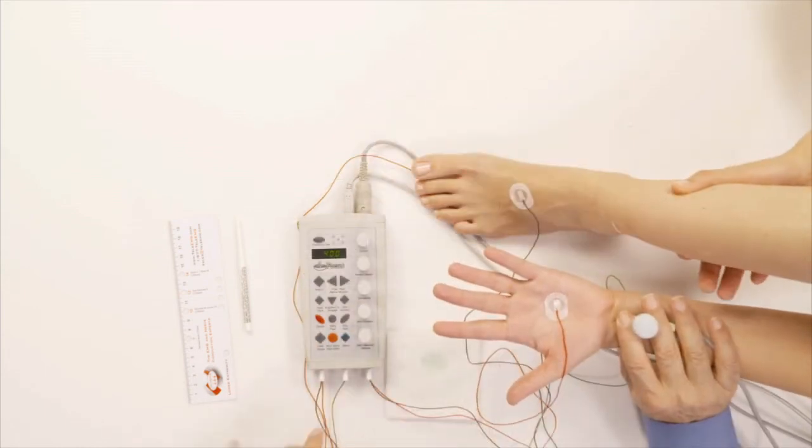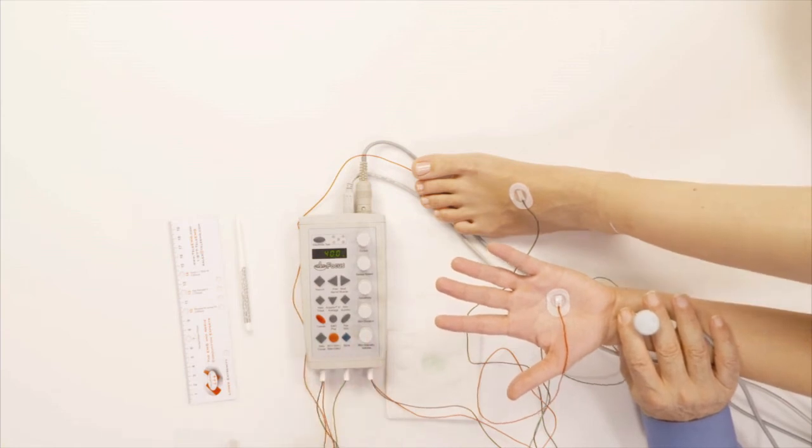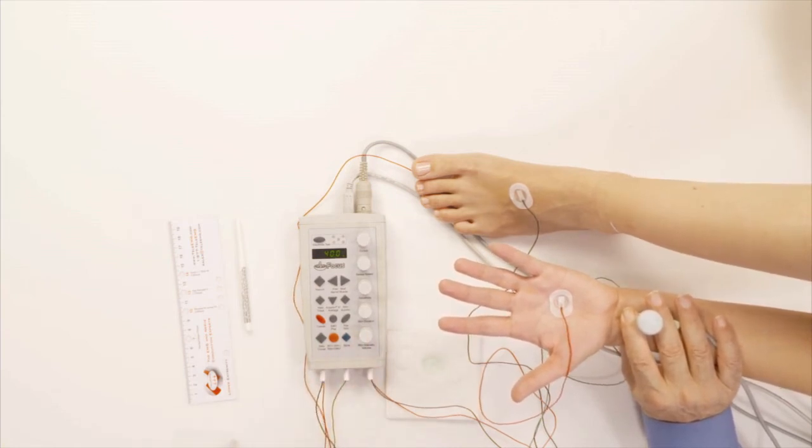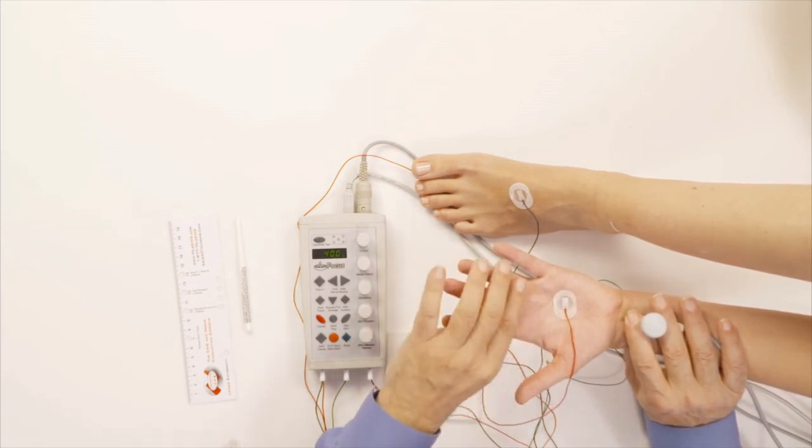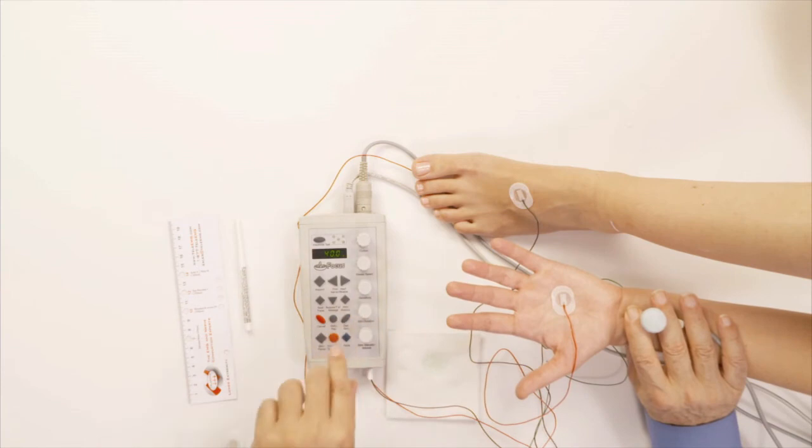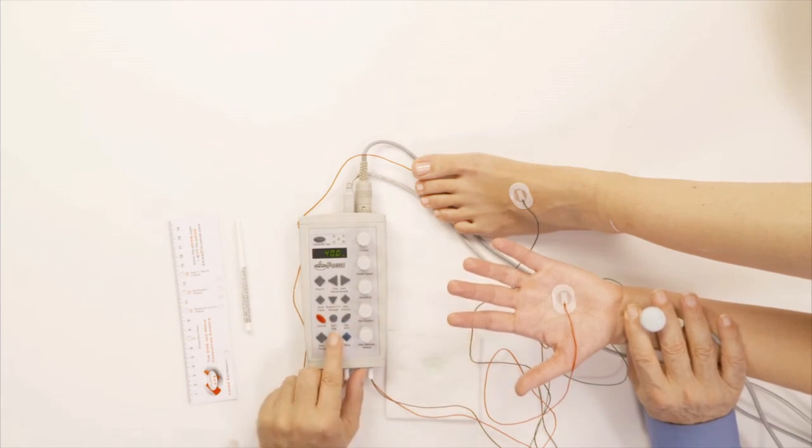So now I put the stimulator at 40 right away. In other words, I don't raise it gradually because I just want to give her one shock to see the reaction from both the hand and the foot at the same time. Relax here. Just one shot.